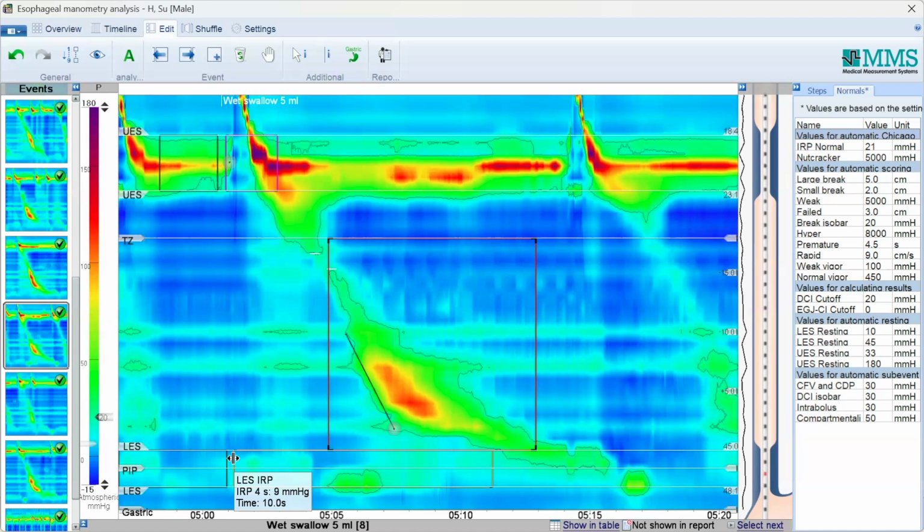By the way, you know that manometry sometimes takes longer than the scope. Of course, especially if it's not done the right way: preparing the patient, insertion, and everything, and explaining to the patient. In the scope, the patient is sedated, and just putting in the scope takes maybe 5, 6 minutes. If it is just diagnostic, with no procedure, no polyp, nothing, it will be easy.